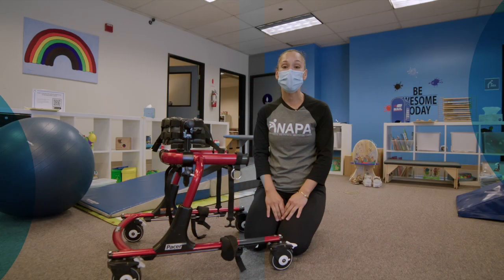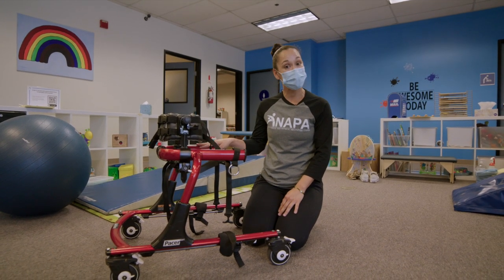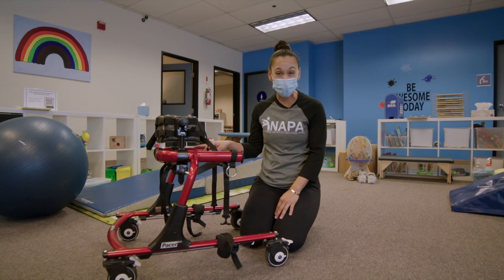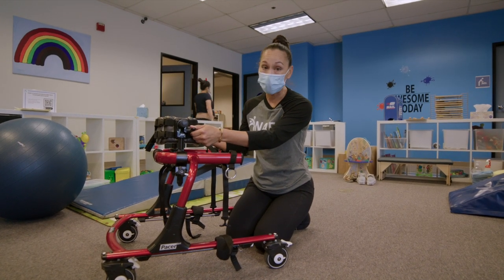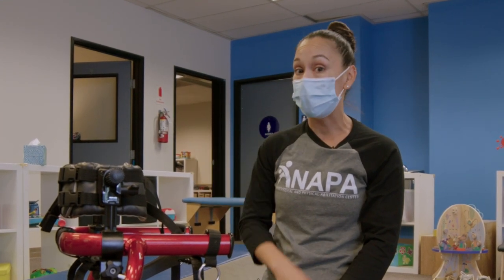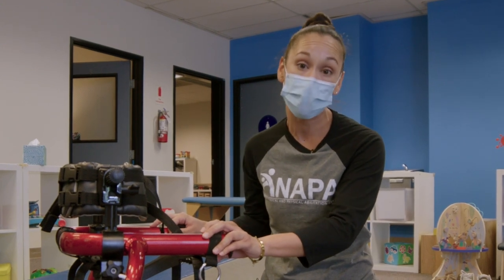Hi, my name is Jess. I'm the Director of Intensive Therapy Services at Napa Center and today we're going to talk about the Rift and Pacer. We love using the Rift and Pacer as one of our main gait training units at Napa for a couple of reasons. One being it's really easily adjustable, no tools necessary, which makes it very parent friendly. Also there are a great number of accessories that you can order with the unit so you can really customize it to what the user needs.